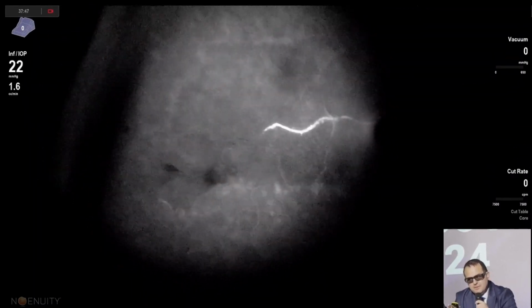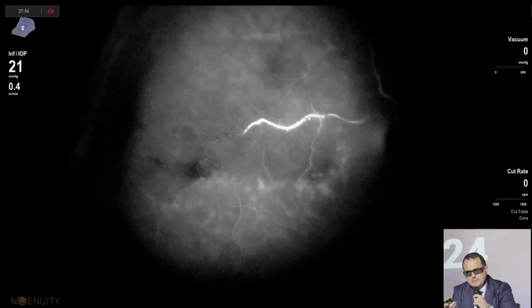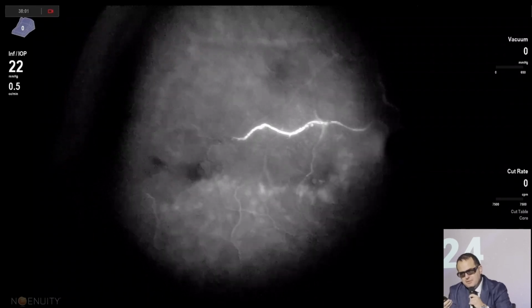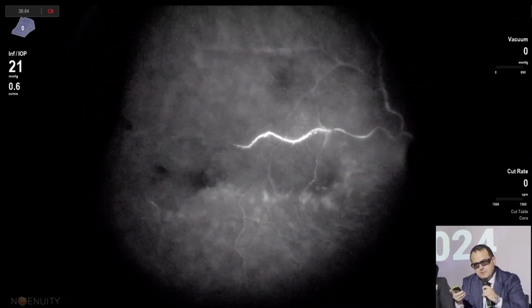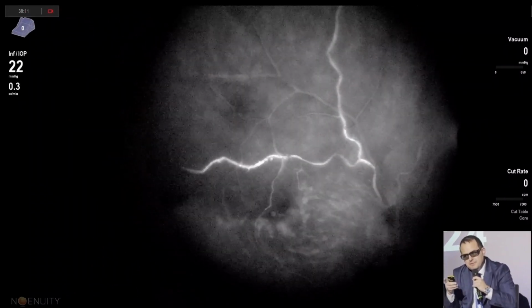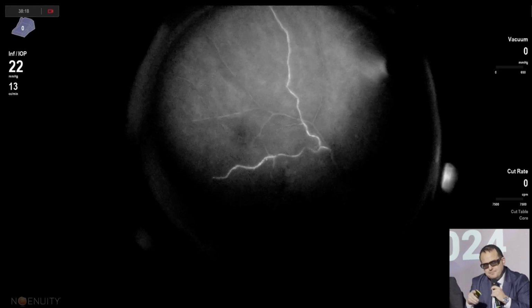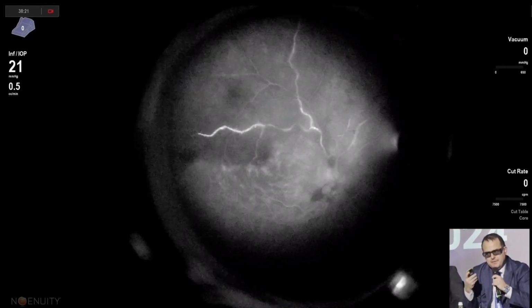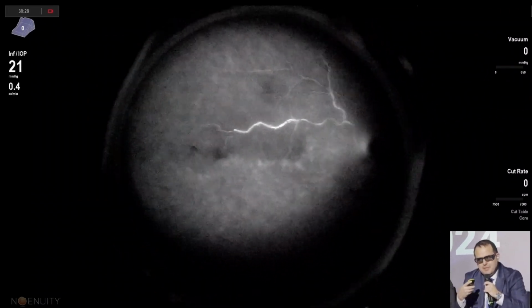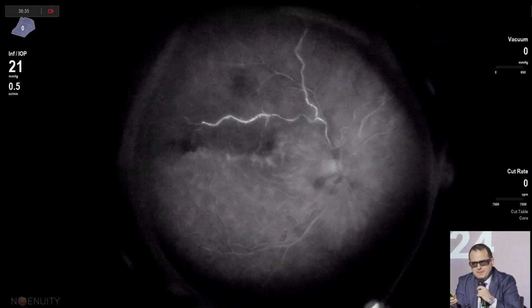So the quality of the image and the resolution that we have is actually amazing. Since this is a vascular case, it is really important to treat or to decide if we're going to treat with laser or anti-VEGF based on something. So the intraoperative fluorescein angio might give us this, let's say, additional information. So you can see here how the perfusion travels through the vessels, and later on we will see end laser which is guided by the non-perfusion areas. So here it is, a good reperfusion.